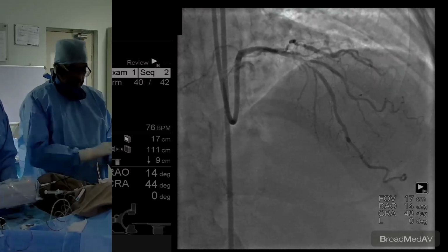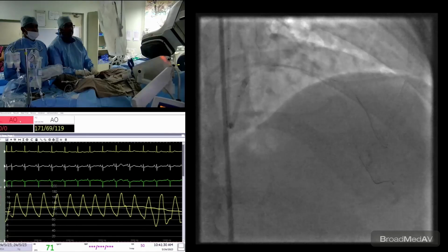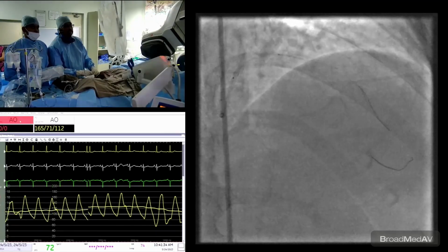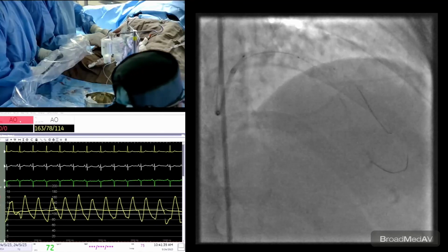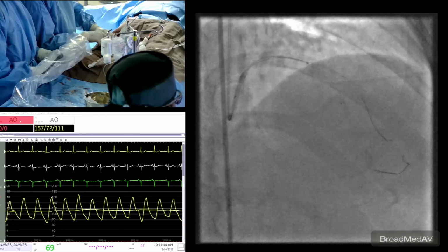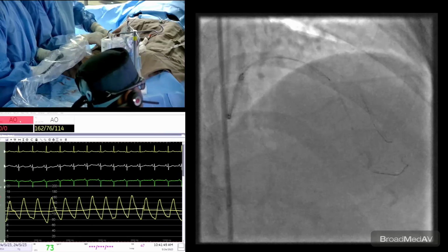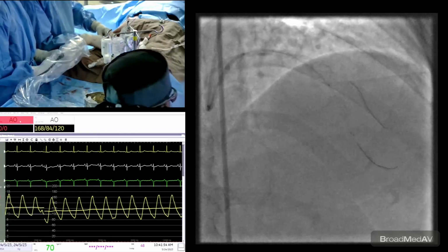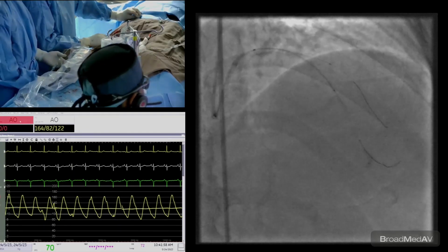So we pre-dilated and now we're going in with an OCT. So we have two diagonals in place and we're going in with the OCT. So here's the OCT catheter. That seems to go in reasonably. So I'm just pulling the LAD wire back. You can see a little difficulty in getting the OCT because of the calcium, but surely it is going forward. And this is a clear sign that there will be calcium here. So this is where we are, and we get the guide in.